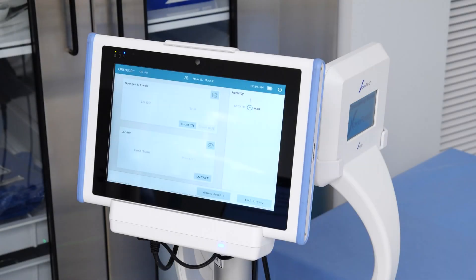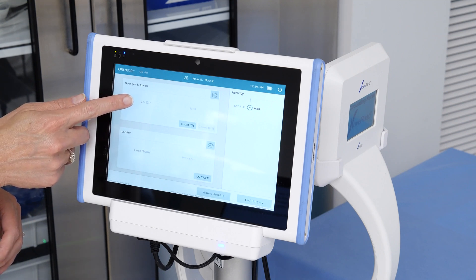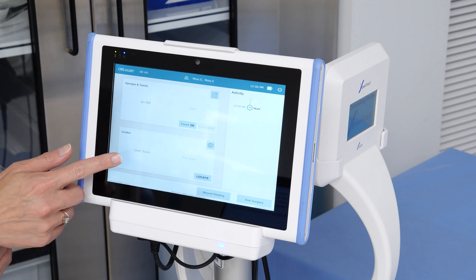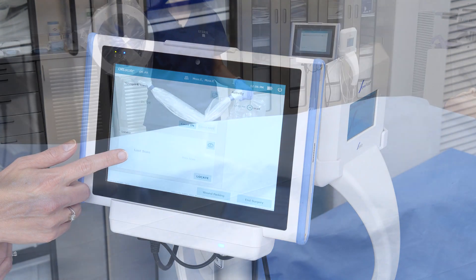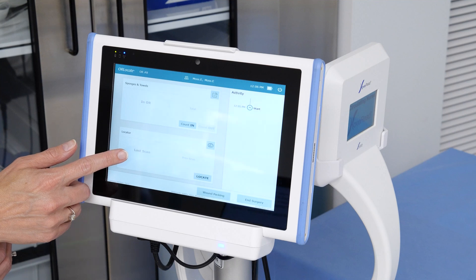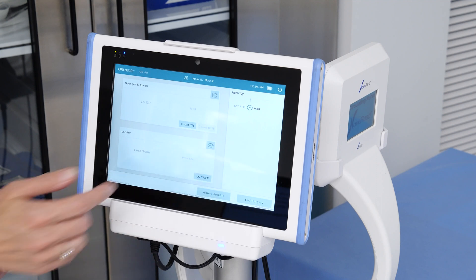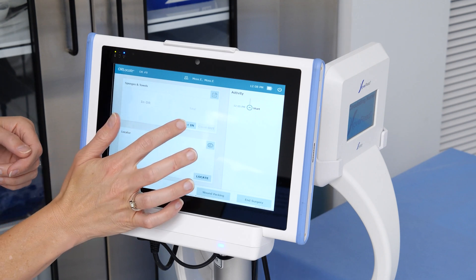Now that you have logged in, you will see the main user interface on the display. The window at the top left corner supports the counting in and out of sponges from the surgical case. If a missing sponge or towel occurs, the window in the lower left corner will be used to initiate the locator wand and identify any missing RFID-tagged sponges or towels found. Finally, the vertical window on the right is the activity window that will show all OR Locate activities that occurred throughout the surgical case.